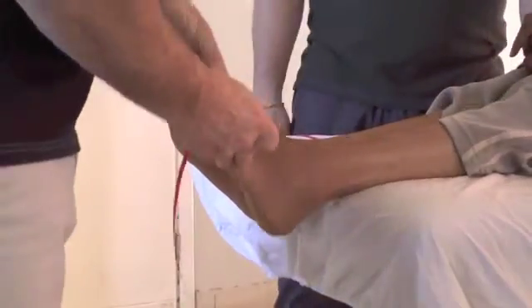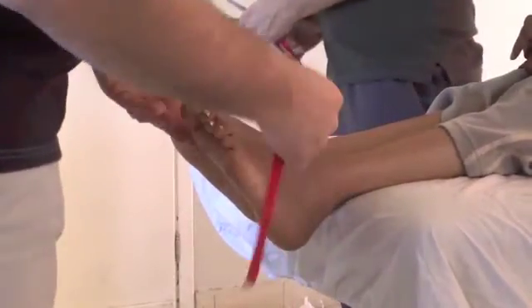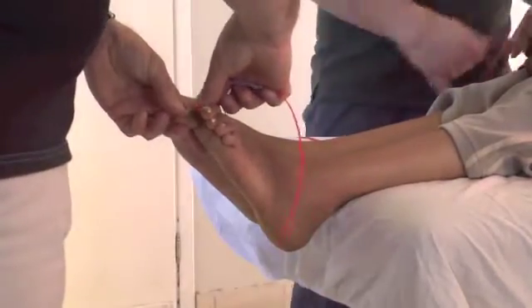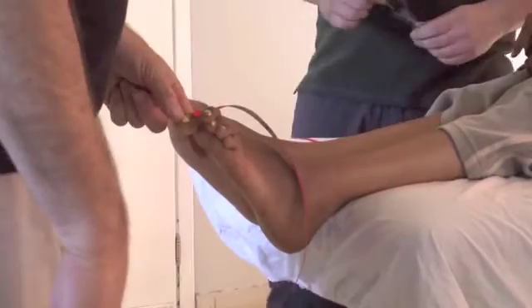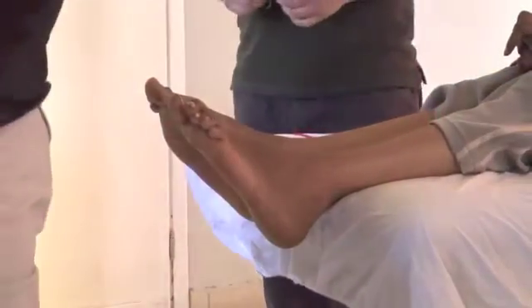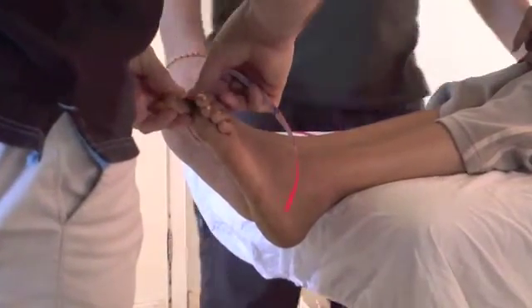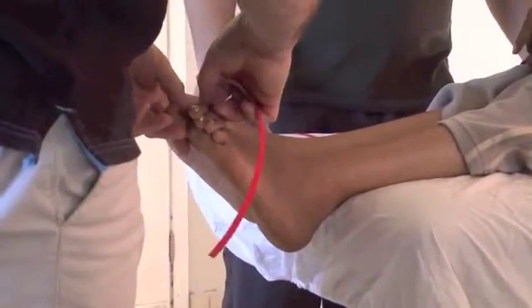So here we have swelling and we have rigidity. So here we're going to put the toe into plantar flexion and to stick — apply the tape with no tension.